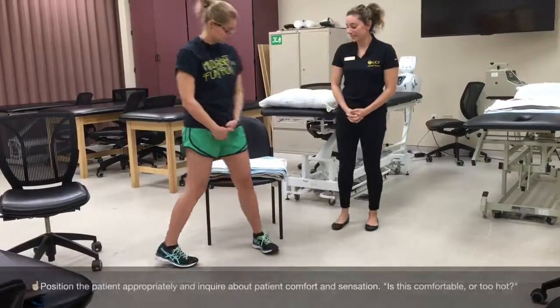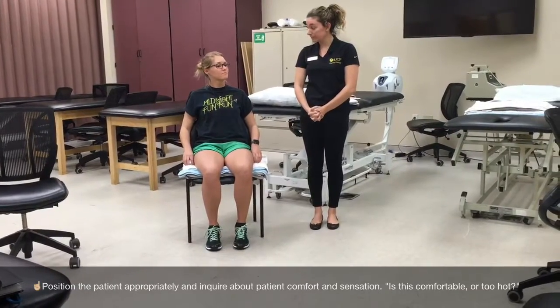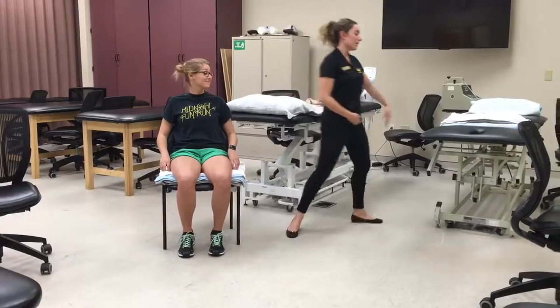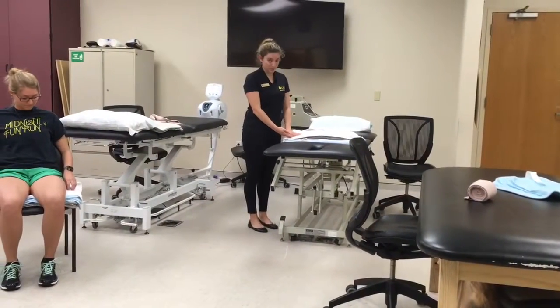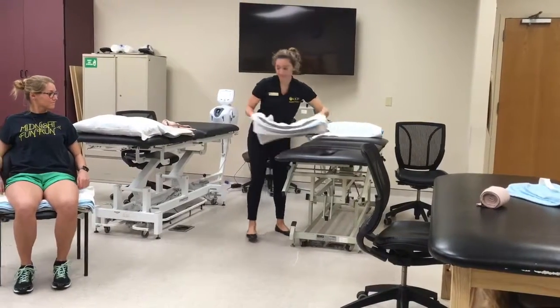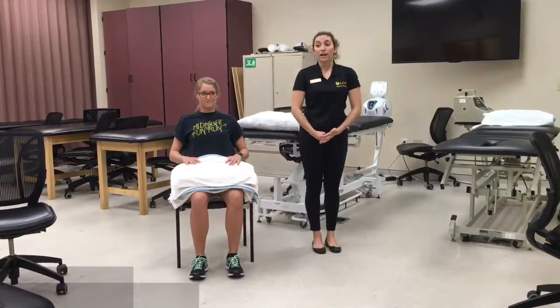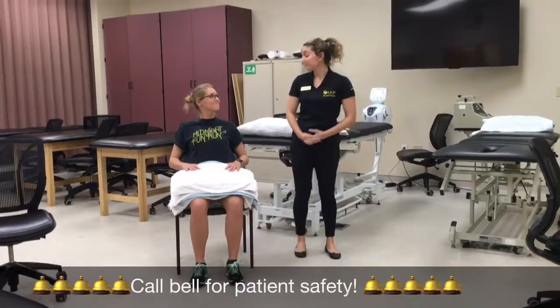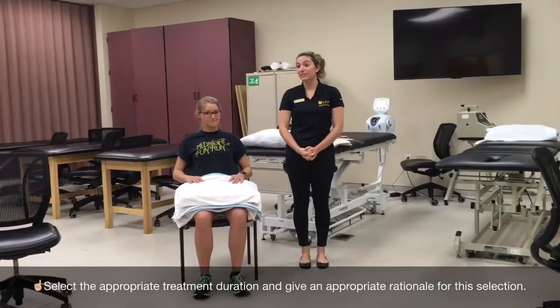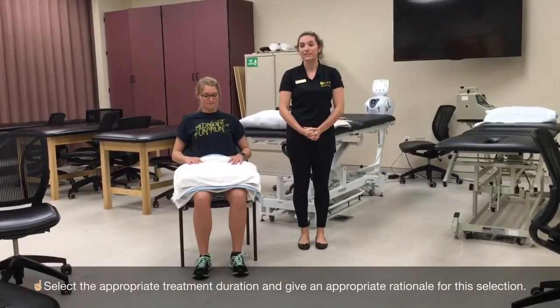Go ahead and sit down. Is that too hot? Good. Now I'm going to go ahead and put the second heat pack in appropriate layers of toweling, which is also nine layers. How does that feel? Good. If it becomes too hot, please ring the call bell that I will provide to let me know. I will be checking your skin every five minutes for a total of 20 minutes. This treatment time is necessary for the hemodynamic effect of vasodilation.